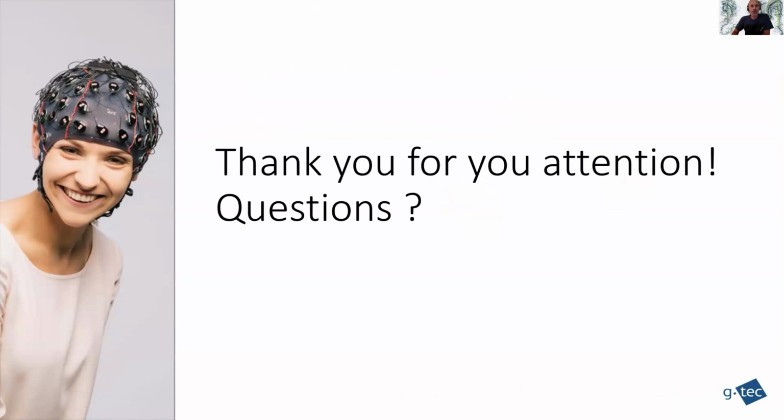Thank you very much for the nice demo. There is a question: can you use eye tracking for the Blondie check? Does it make sense? Just if you want to study at which particular region of the face the subject is looking, so that would be the only gain in information. Keep in mind the Blondie check does something that is faster than the reaction time. We are extracting, after a couple of hundred milliseconds, the information that we need for ranking the pictures. So eye tracking would be slower, and you would do it on purpose.